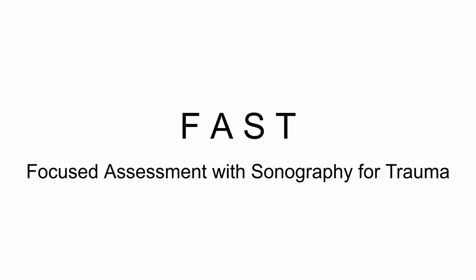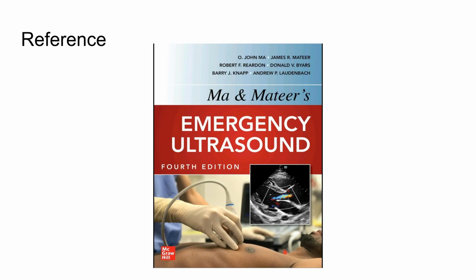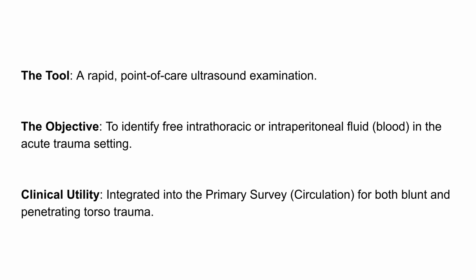This video will cover the focused assessment with sonography for trauma, commonly known as FAST. The information presented is based on Ma and Mateer's Emergency Ultrasound, 4th edition. FAST is a rapid point-of-care ultrasound examination. Its objective is to identify free intrathoracic or intraperitoneal fluid, which is typically blood, in an acute trauma setting.